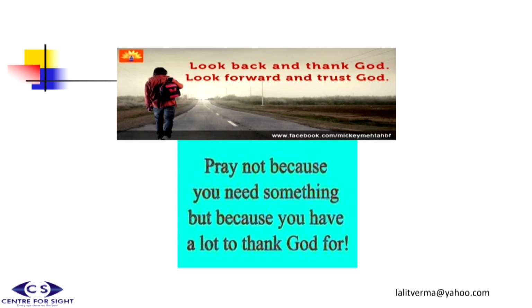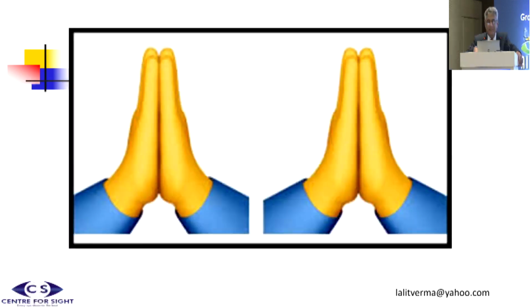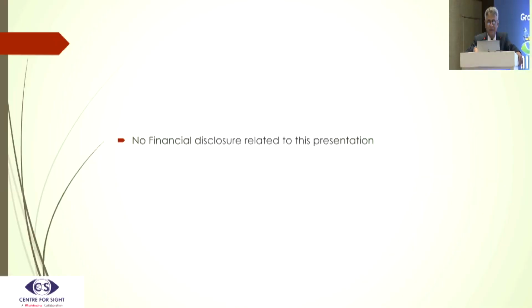Sir, please. Thank you, Vrinder. I think deliberately he has given this topic to me because all these are young people. They've recently acquired OCTA machines and they have a lot of experience. And I, being all gray hairs, am more using the FA machine and gradually learning OCTA. Thanks, Vrinder, for designing this session so well.